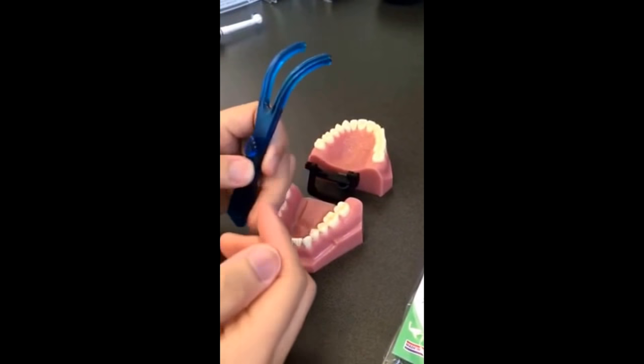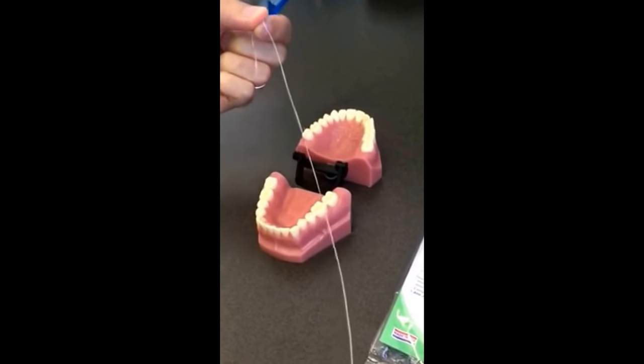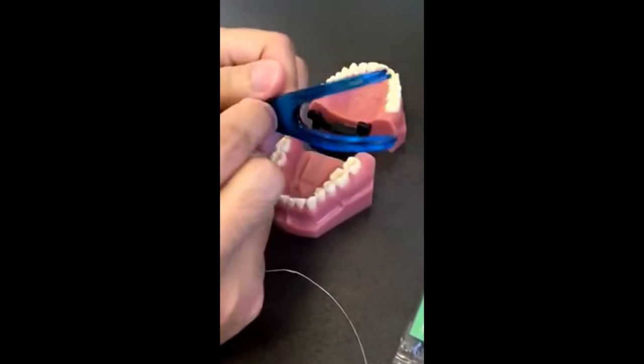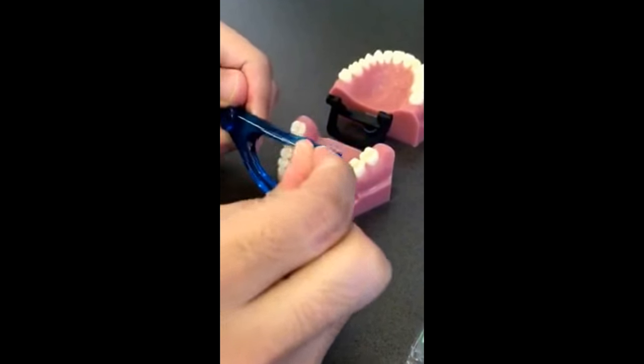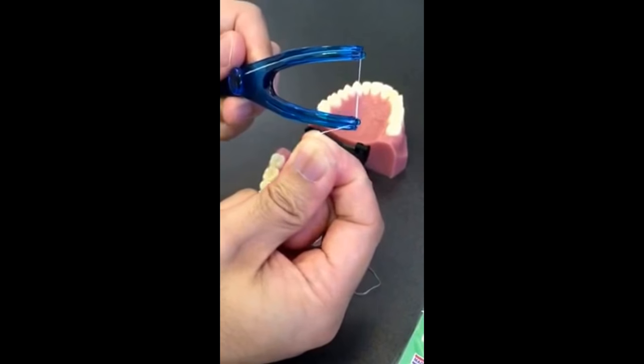Start with about 30 centimeters of regular dental floss. Wrap one end around the button on the base of the handle twice. Then thread the floss up across the arms of the Flossmate and back down around the button again.